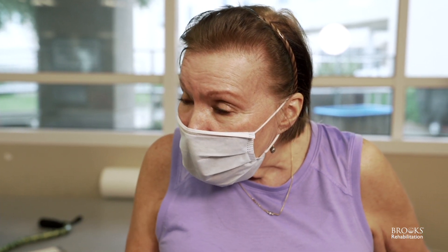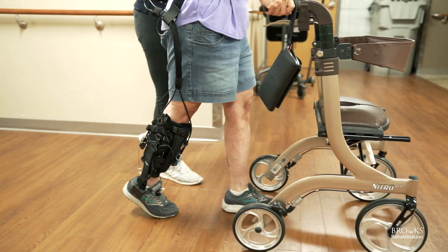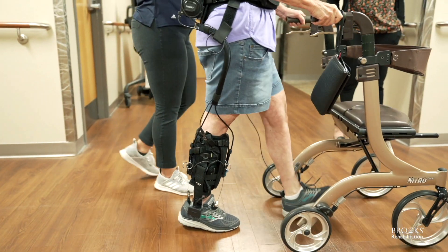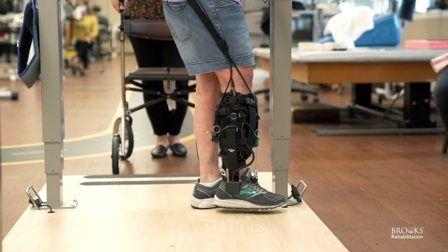We're seeing increased step count, increased comfortable walking speed, increased max walking speed, and less compensations around the hip, even with just the first few sessions of utilizing it. It helps me pick up my toes so they don't drag. It helps me feel like I have better balance, and it helps me walk faster.